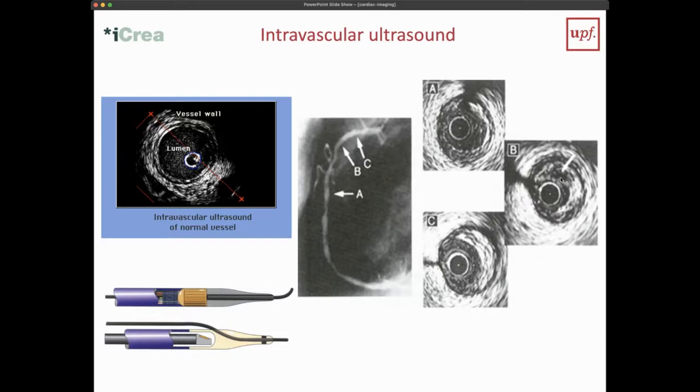First of all, you use a catheter, and in patient applications, catheters are in principle for single use because of problems with sterilization, potential infection, potential failure. Most of the catheters that we use are for single use. A catheter like this costs almost €1,000. So this would add €1,000 to every examination, which of course is not feasible.